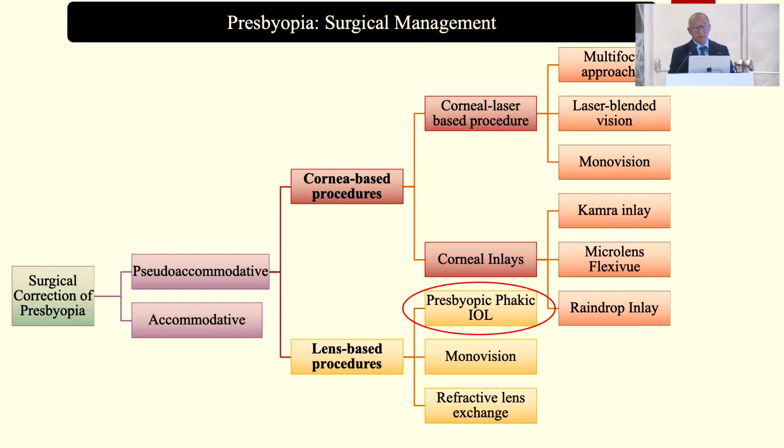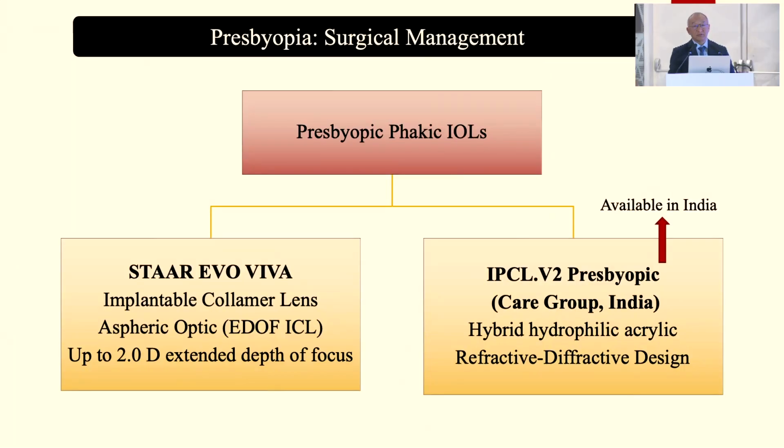These are the surgical options for tackling presbyopia in this age group, and I'm going to talk about presbyopic phakic IOLs, because this is one concept we have taken up from the ICL Star, which has been there for more than 2 decades. Subsequently, so many ICLs or phakic IOLs have given such good results for myopic and hyperopic patients in a younger group. So I thought let's try these in a group of patients with presbyopia.